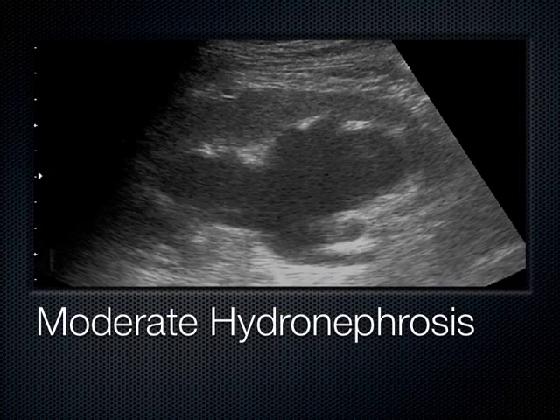This is what happens when we get a lot of hydronephrosis backing up in the kidney. Our cortex is starting to go away, and all those finger-like projections are now coalescing into one large hypoechoic or anechoic area seen in the pelvis of the kidney, and that's more like moderate hydronephrosis. When all those fingers come together, we can still make out the cortex though. See out here, we can still see cortex. If all I saw was a big black center where the kidney should be, and there's no cortex left, it's very, very rare, but that would be severe hydronephrosis. The fact that I can still make out cortex tells me this is probably moderate.